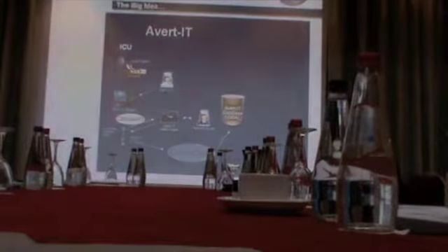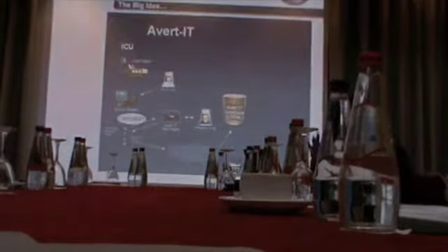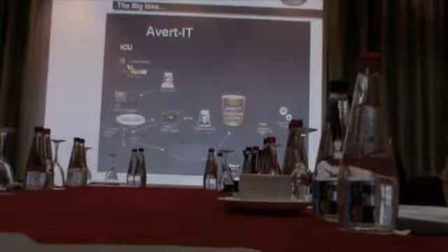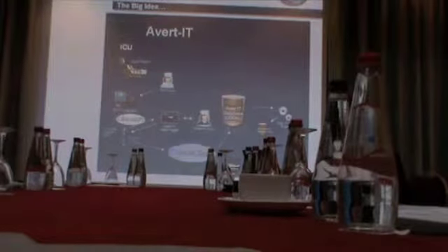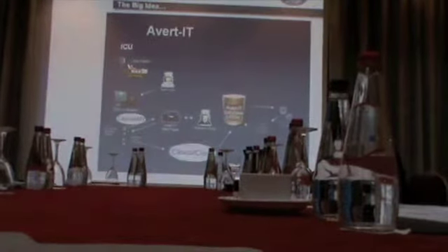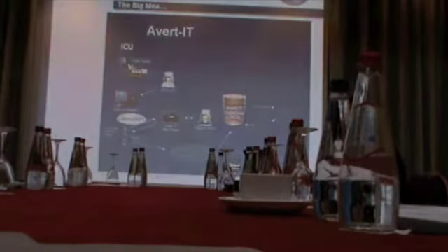At every local site, we want a standard database, a standard description of all the data coming out of the ICU. Based on that, Rob and Tim's Hypopredict work can start happening over to the right here, and that makes calculations and predictions based on what it finds coming out of the ICU.